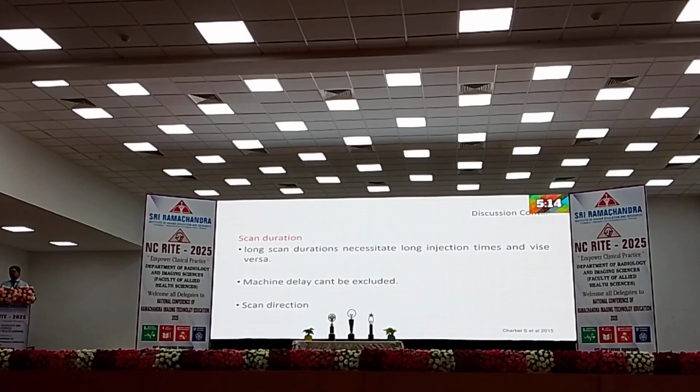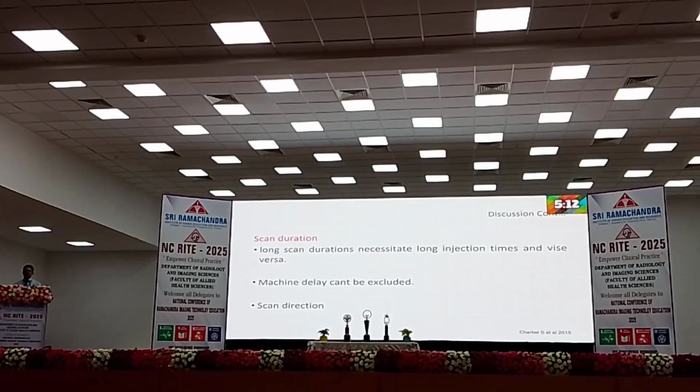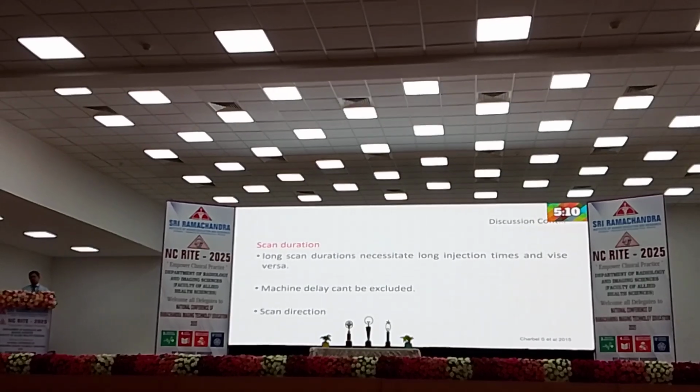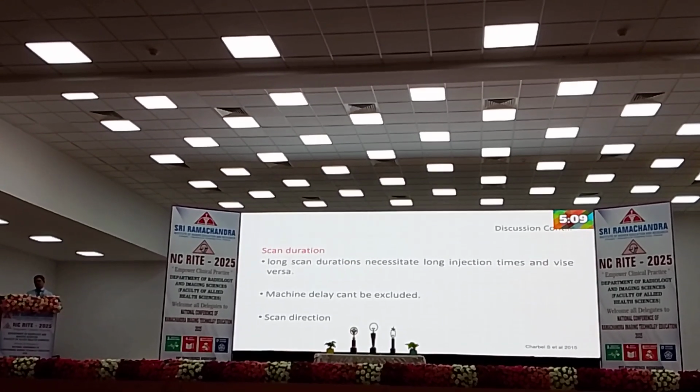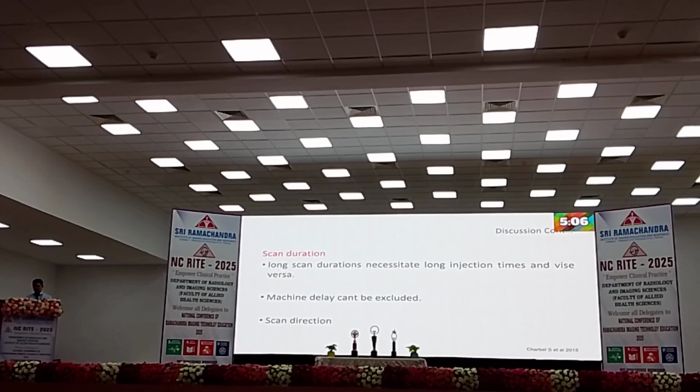So whenever you are conducting a scan, duration is very important. If you have a longer scan duration, you should have an even, constant flow rate of the contrast, and the saline chaser is very important.